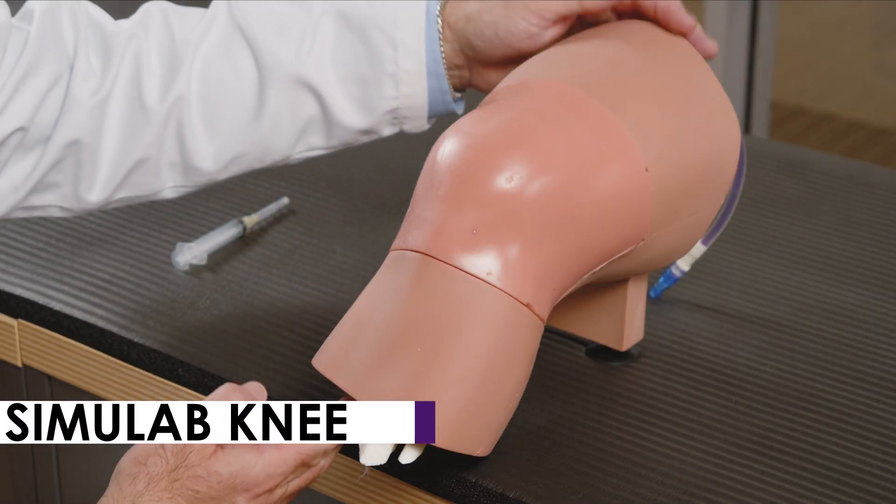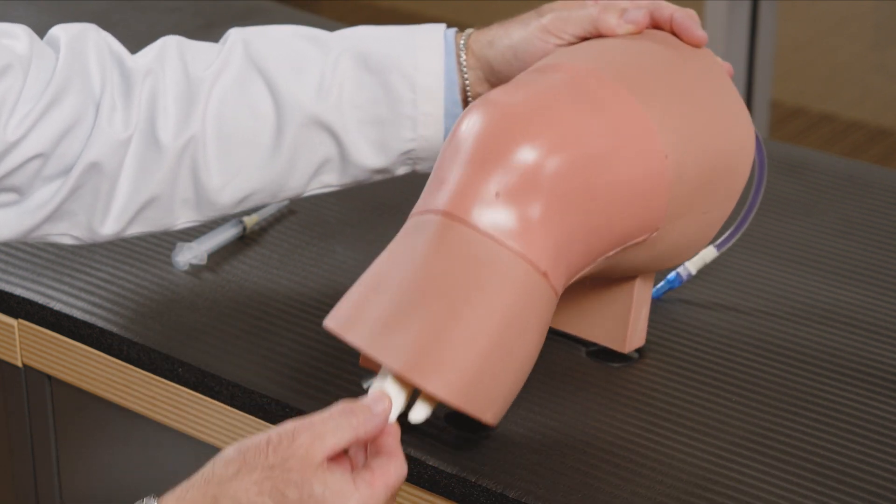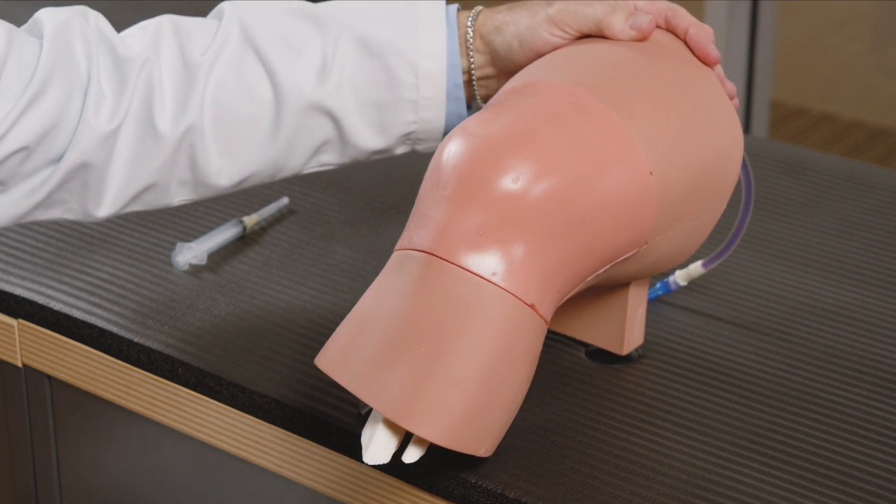We're now going to demonstrate the knee injection technique using the Simulab knee. The great thing about this knee model is that it is anatomically correct with the bones — the fibula, the tibia, the patella, and even the femoral head — and it can be done using ultrasound.